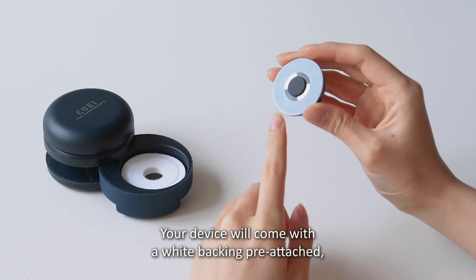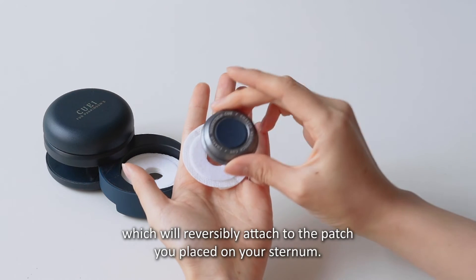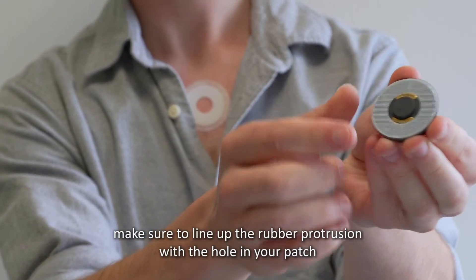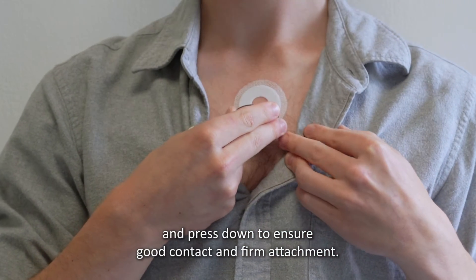Your device will come with a white backing pre-attached, which will reversibly attach to the patch you placed on your sternum. When putting the device on, make sure to line up the rubber protrusion with the hole in your patch and press down to ensure good contact and firm attachment.